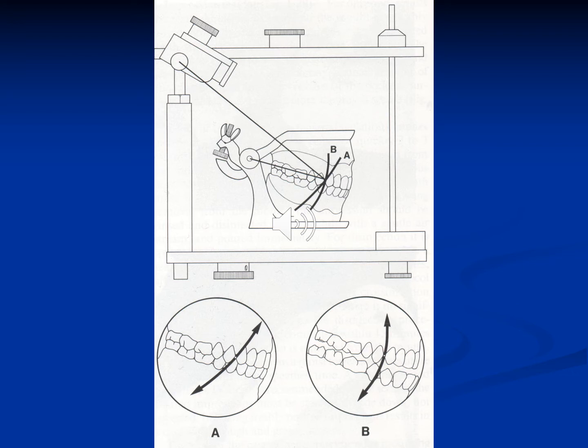Now here in this photo we can see a comparison between a simple hinge articulator, which is a class 1 articulator, a non-adjustable one, and one of the more sophisticated, either average value or higher classification articulators. Now we can see that the simple hinge articulator is going to close according to the arc B. So it has a more vertical closing direction, simply because the occlusal plane is located higher and closer to the condylar element, which represents the center of rotation, closing and opening movement.